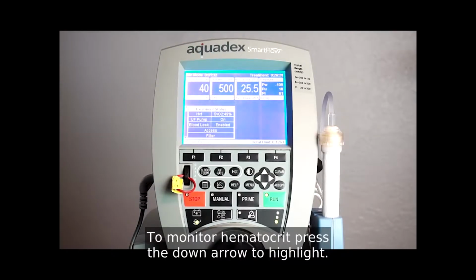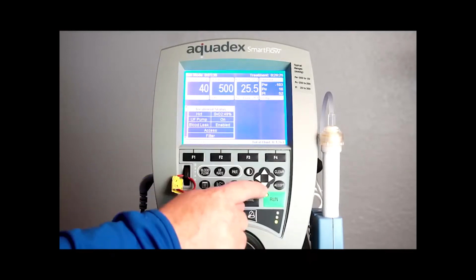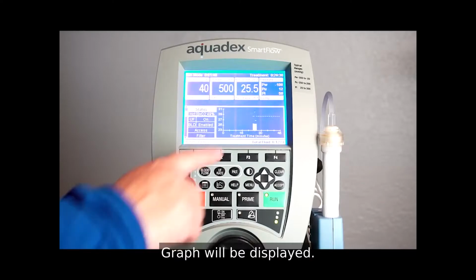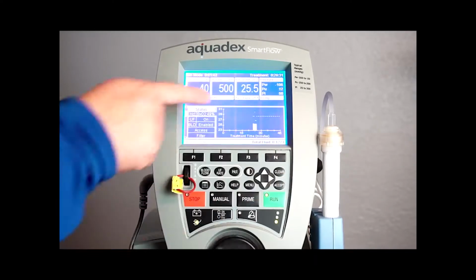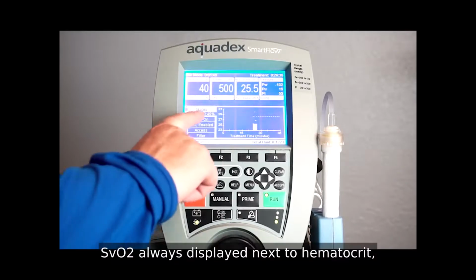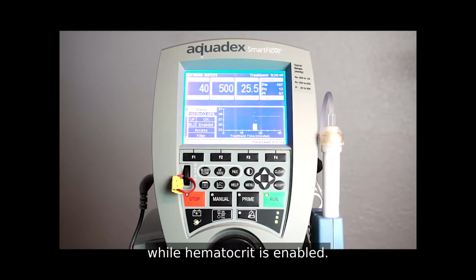To monitor hematocrit, press the down arrow to highlight. Graph will be displayed. Limit is the dotted line. SVO2 always displayed next to hematocrit while hematocrit is enabled.